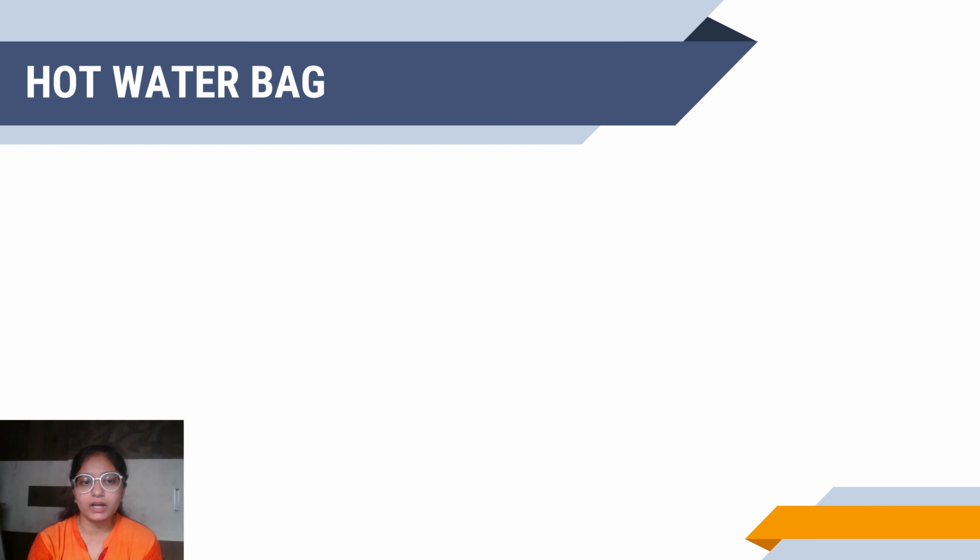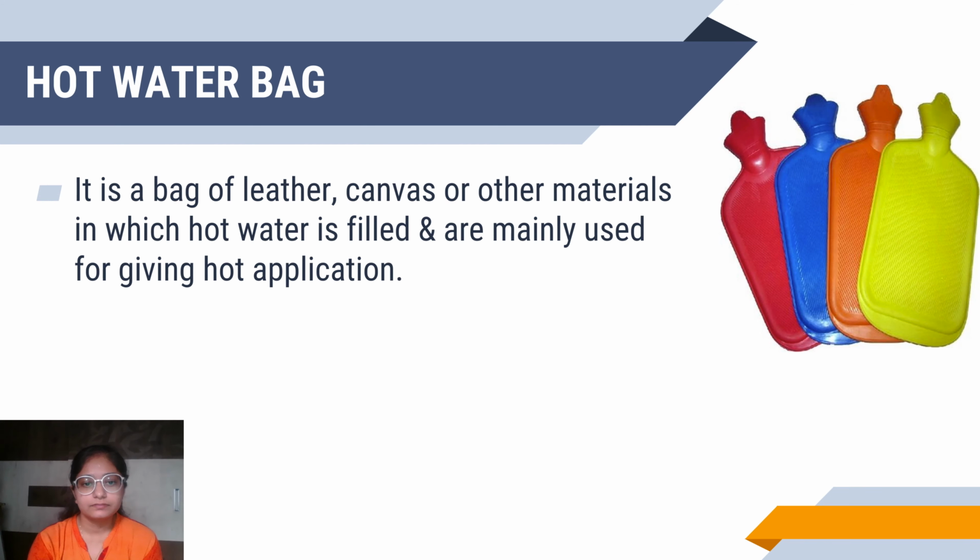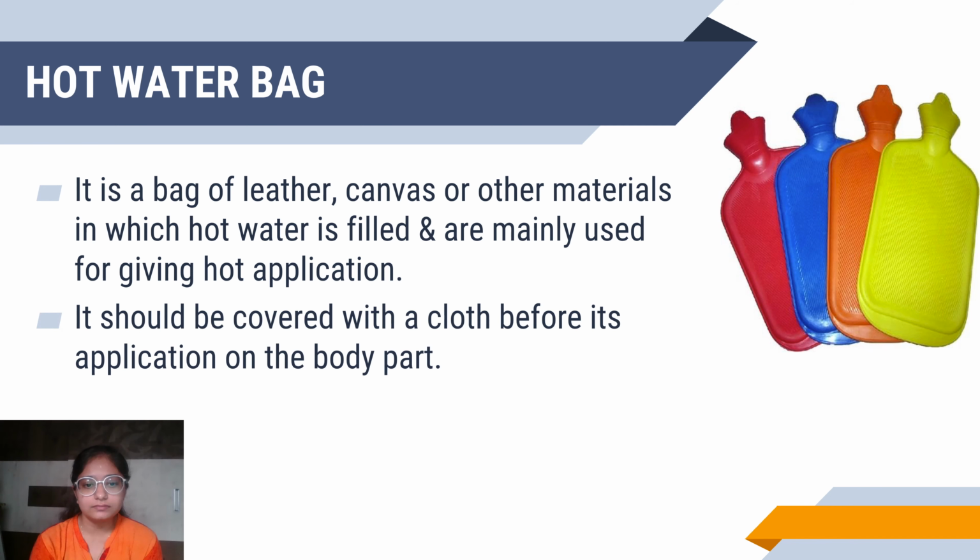Next is hot water bag. This is a picture of a hot water bag. A hot water bag is a bag made up of leather, canvas or any other material in which hot water is filled and is mainly used for giving hot application. One important care while applying the hot water bag is to first cover it with a cloth before application on the body part, to prevent friction and irritation from the rubber material.